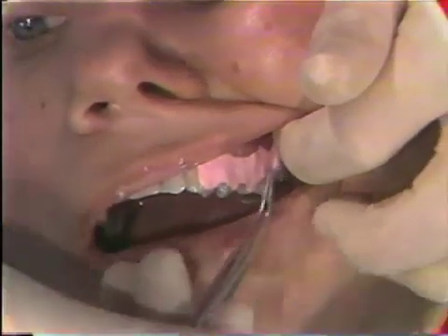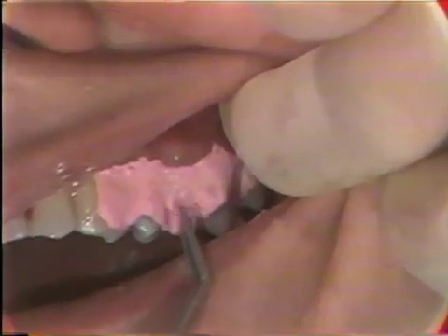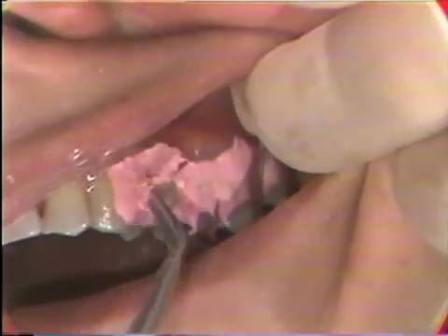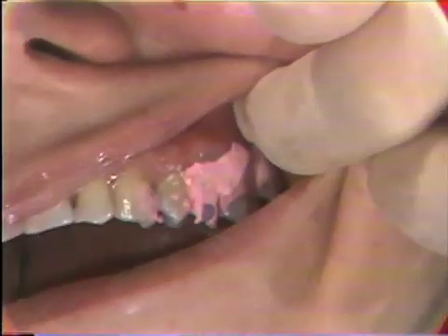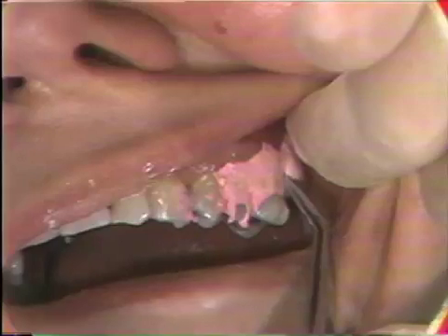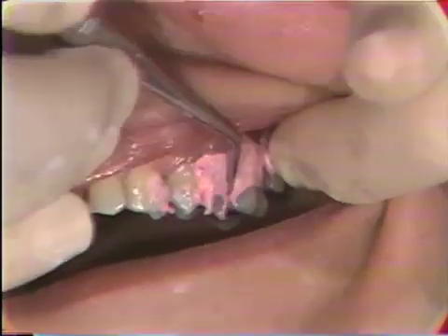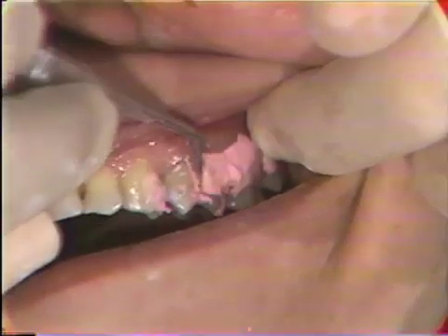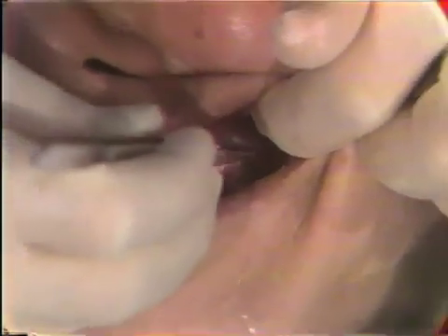Darlene gives the cotton pliers, and these cotton pliers in a closed position will be used to press the dressing material interproximately. Notice how this is being pressed interproximately, initially from a coronal position. We don't need dressing material on the first bicuspid and up to the cuspid, so that will be removed — a sponge is right there to pick up the excess. Then going between the molars to again press the dressing material interproximately, and also from the gingival margin to press it interproximately, providing the mechanical lock to keep the dressing in place.